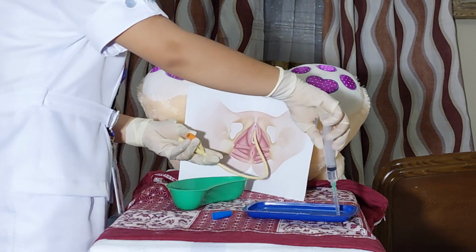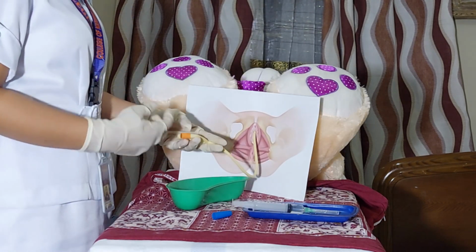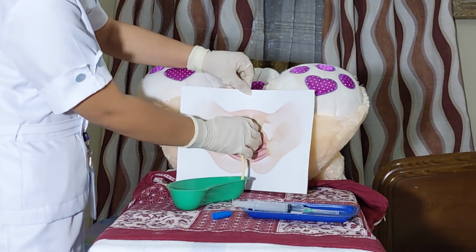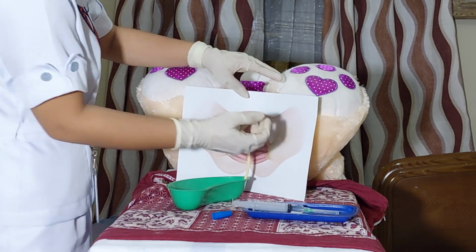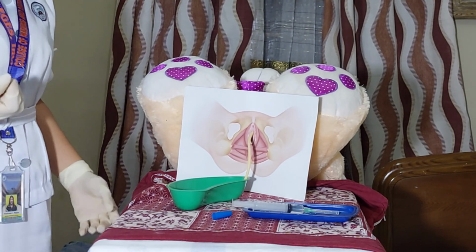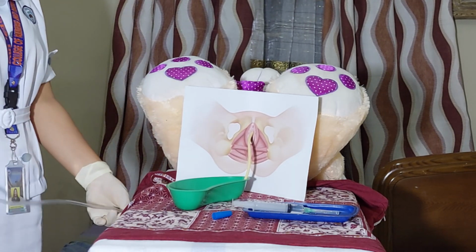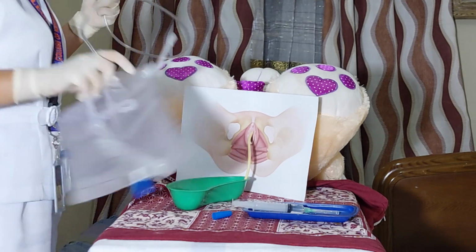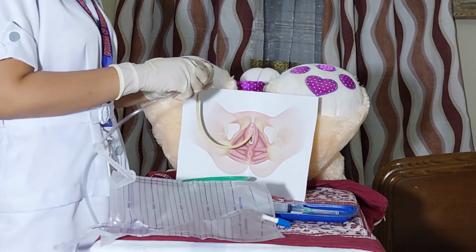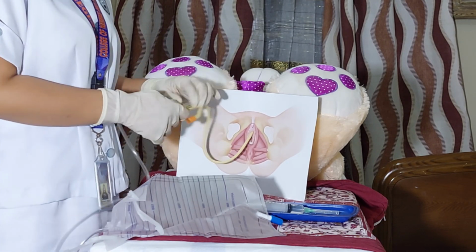To check if our Foley catheter is secured, we can gently tug on it. If it doesn't come out, it means our Foley catheter is secured. Now I can connect it to our urine bag, so that we can measure the urine outflow.